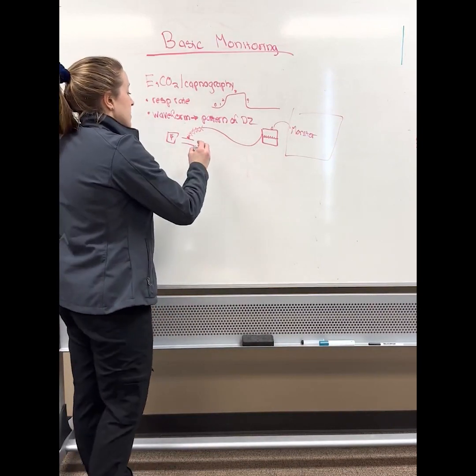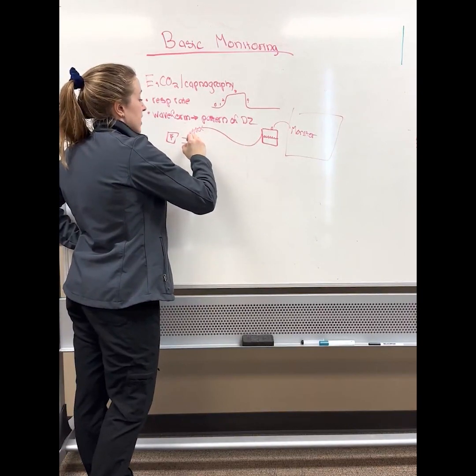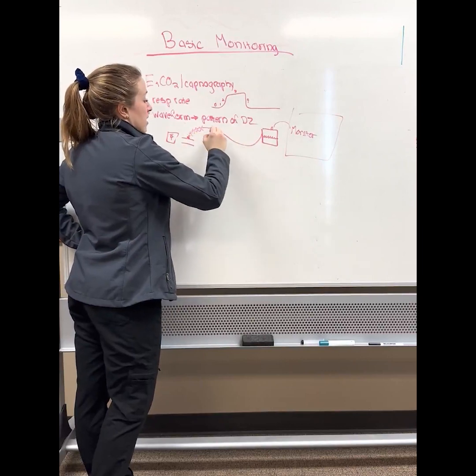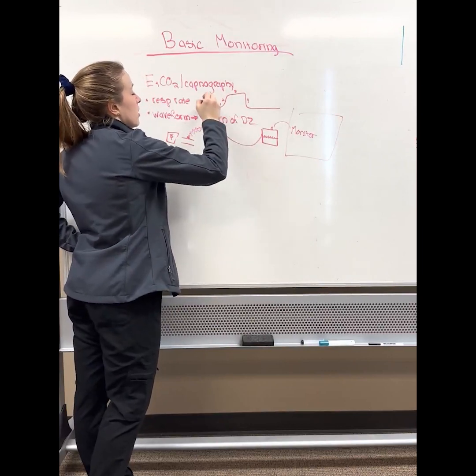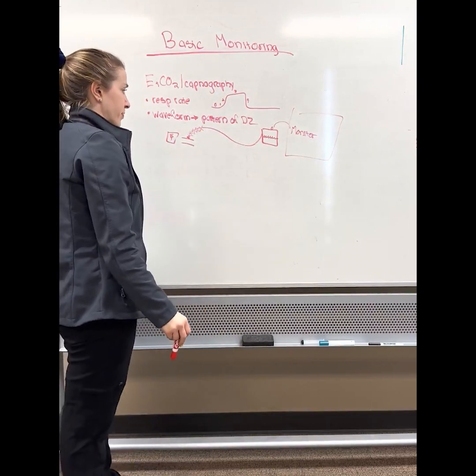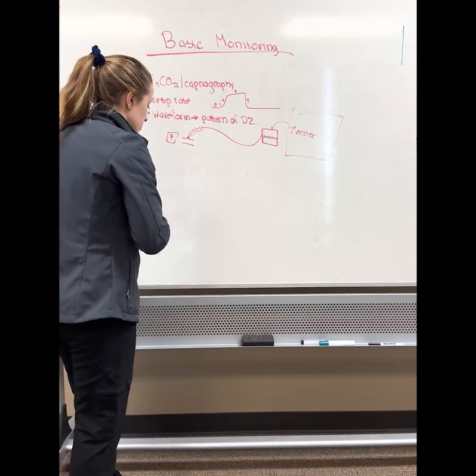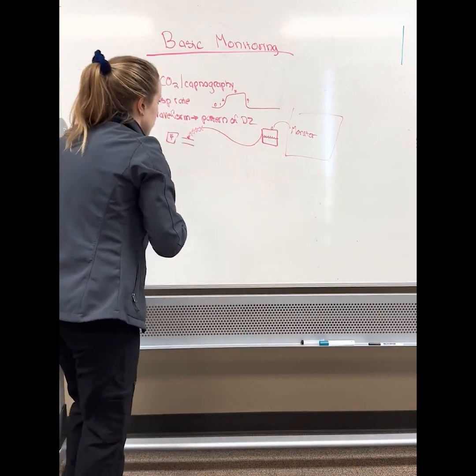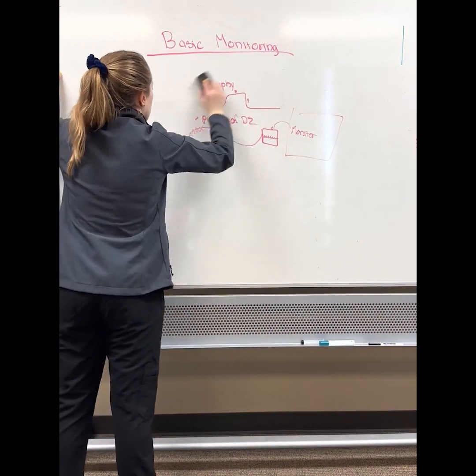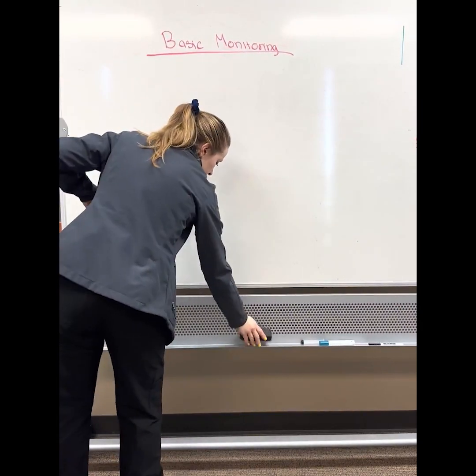And basically what happens is that the machine is going to aspirate air from the endotracheal tube and use that as a sample to read the CO2 and generate the waveform. So that's basically how capnography works. So not only about breathing, but about cardiac output. Just remember that.